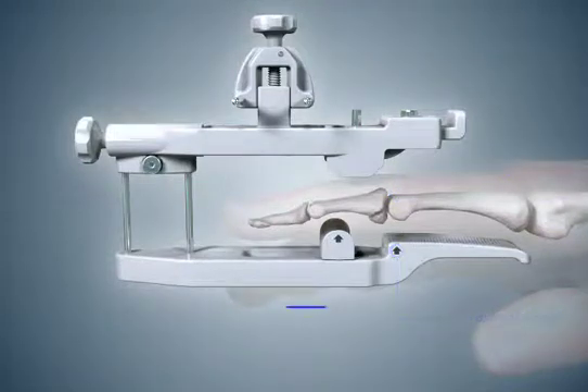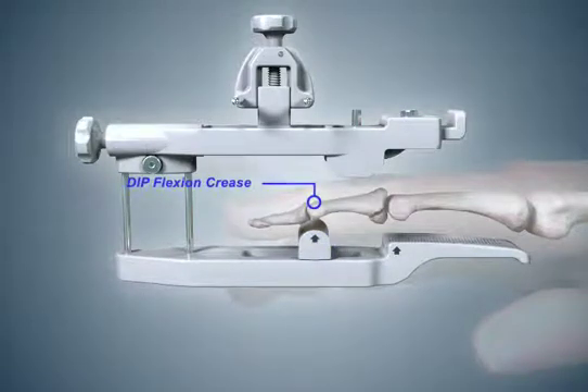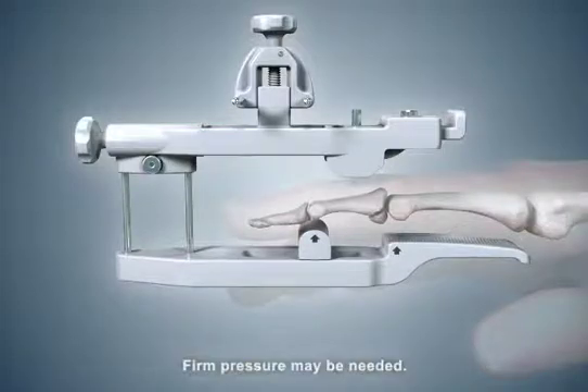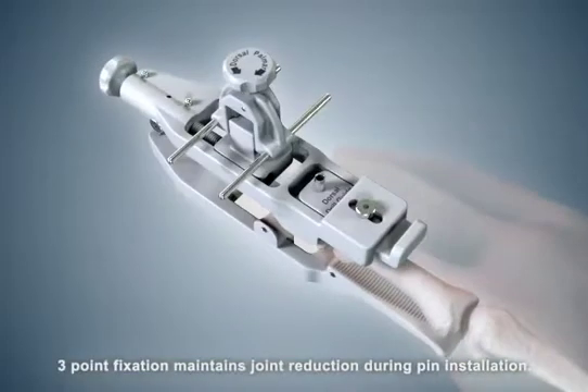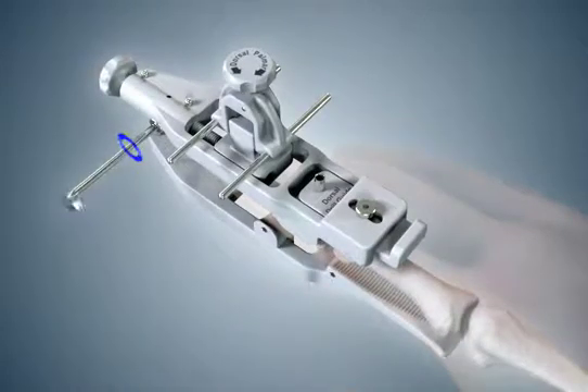Slide the distal pad until the distal arrow aligns with the DIP flexion crease. When this is done, reduce the subluxed middle phalanx by simultaneously applying manual traction to the fingertip while lowering the dorsal beam onto the finger. Lock the distal lock screw to maintain joint reduction.